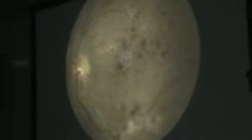This is her left eye. You see fibrosis. And fibrosis is like cotton wool, like cobwebs. And under that, you have all these new blood vessels. And she had a whole band of fibrous tissue going down and going up. You see her macula. The center is already threatened. So she had to go abroad for treatment. We could have done laser here, but vision prognosis is poor, and if that fibrosis band contracts, it could precipitate a detachment. So again, she was really young, 47.